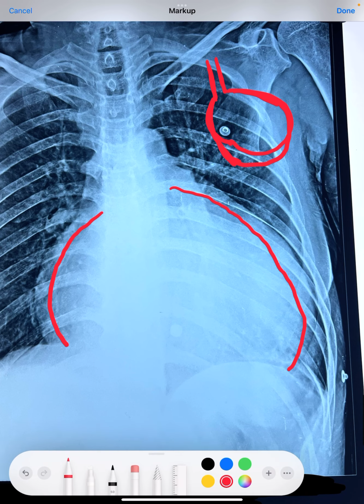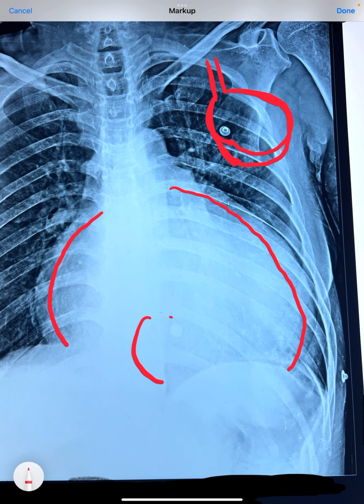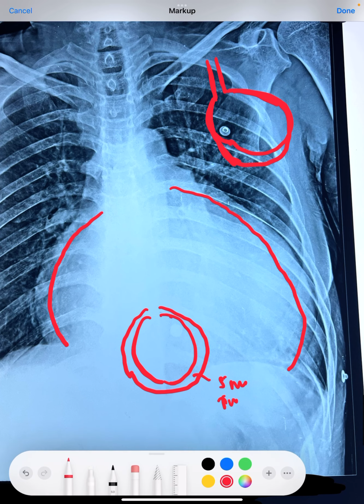We know that the heart has a pericardium. It is a very thin lining outside the heart. This pericardium normally has hardly around 5 ml of fluid, but whenever we have a huge amount of fluid inside it, or blood inside it, what you will get is a huge pericardial effusion.